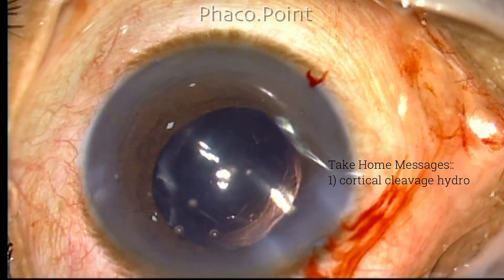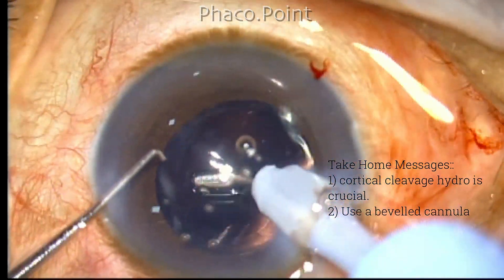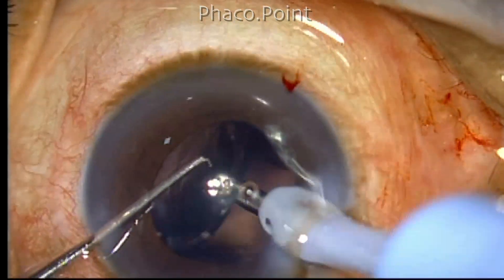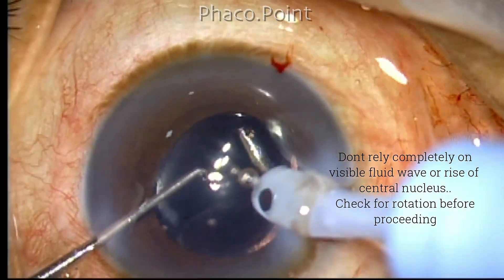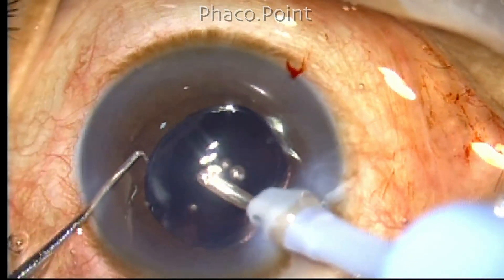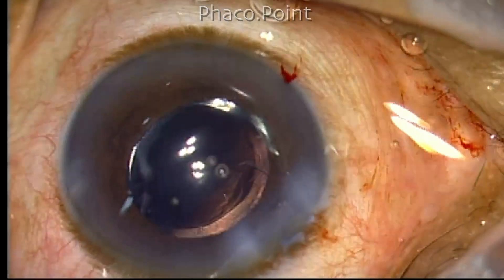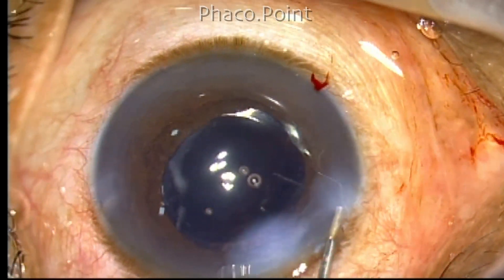The most important thing in getting the nucleus to rotate is to get the right plane of hydrodissection. The instrument that will really help you is a bevel-type cannula — take it to the periphery, slightly tent the anterior capsule, and then inject a firm fluid wave to cause cortical cleavage hydrodissection. It is also a good idea to check for rotation of the nucleus before attempting phaco. And even if you do not get the right plane and the nucleus fails to rotate, remember you can do an in-situ chop, create two or three fragments, and the aspiration flow rate will free up the corticocapsular plane so the nucleus will begin to rotate.